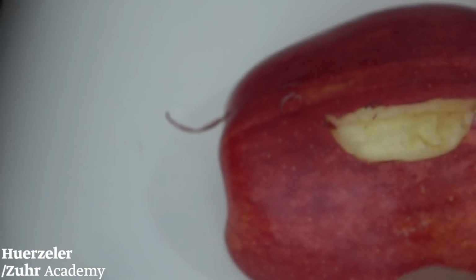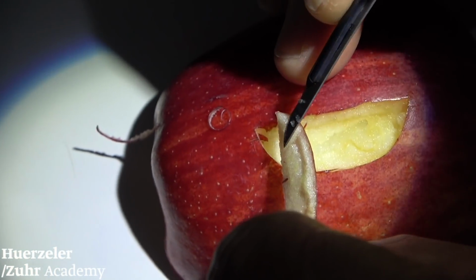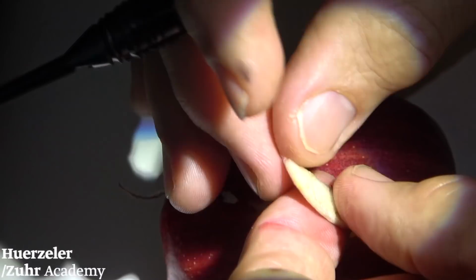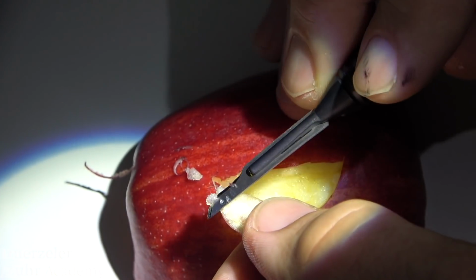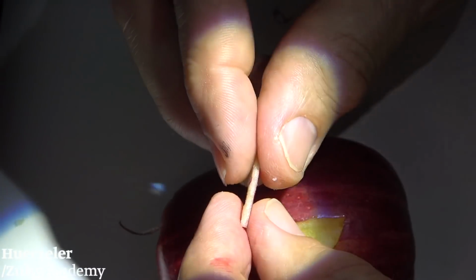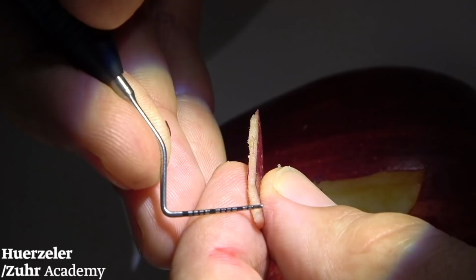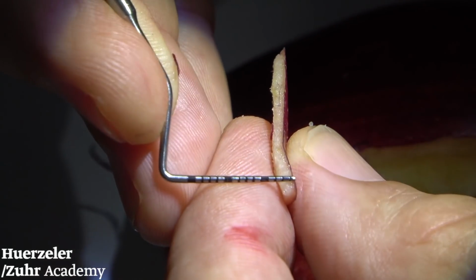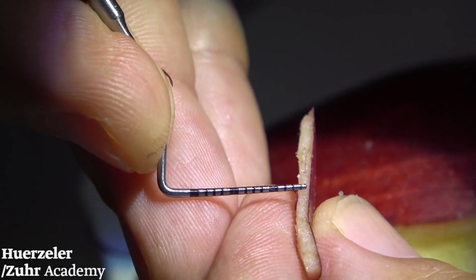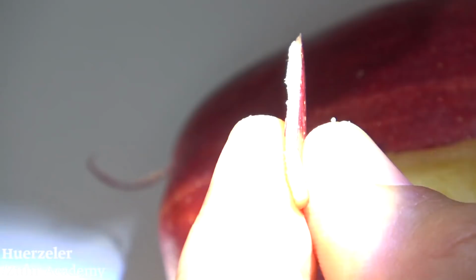Oh, this exercise is absolutely not forgiving. Here I'm a little bit too thick. Take this off a little bit and a little bit here. So, now let's have a look. This is the most important part of this flap. This is the coronal part of your flap. You see that? Has a thickness of 1.5 millimeter. You have an equal thickness everywhere. This is the design of your coronal flap.